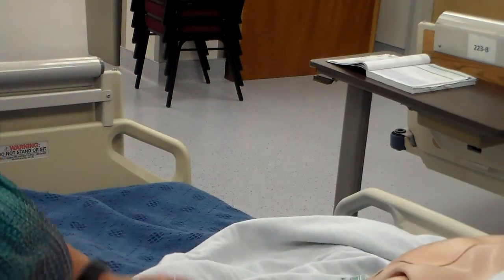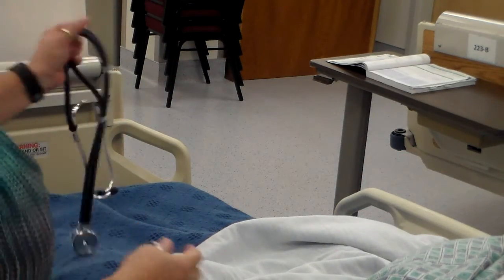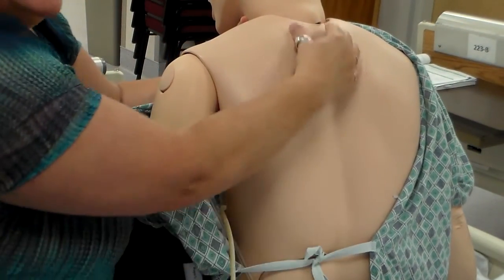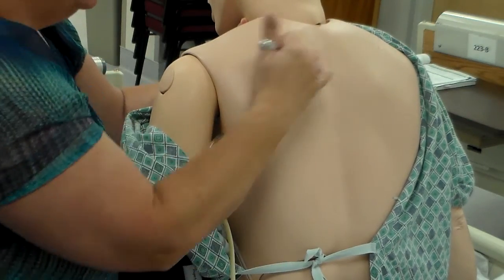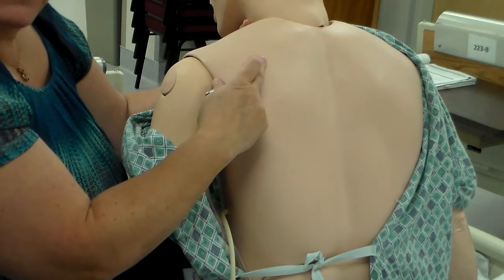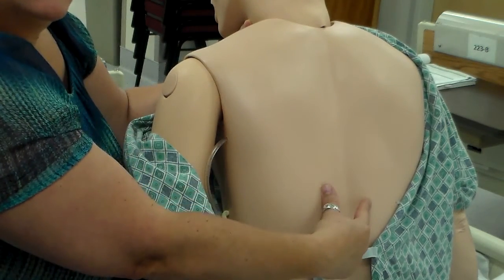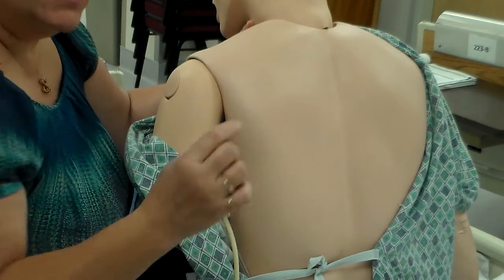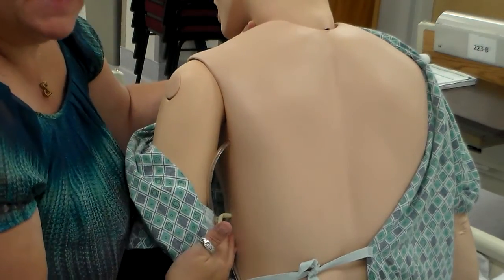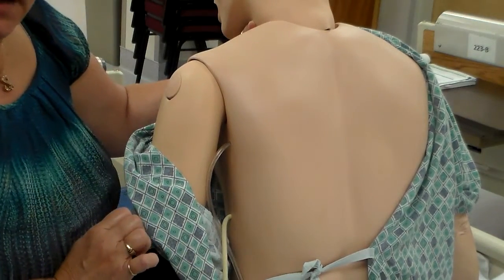Now, when you are moving down the back, I guess I should show you. You want to keep it in between the shoulder blades, because you're not really going to be able to hear anything over the shoulder blades. So putting your stethoscope over here is not going to do you any good. It's going to be more along in this line, right along the spine. You're really going to be going just on either side of the spine to listen. And as you do, you're going to move out, because the rib cage moves out, right? So it's here, here, here, and then out to the side.